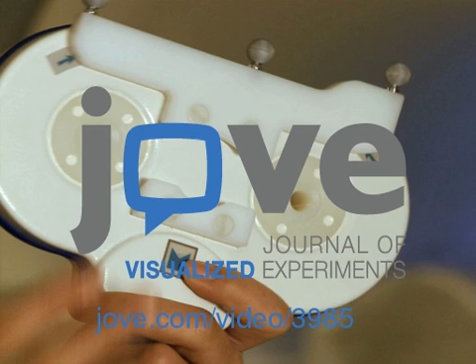On the day of the TMS experiment, set up all equipment, starting with the frameless stereotaxy system. The computer system must be positioned outside of the scanner room adjacent to the door, which will be open during TMS application. The system's registration tools and trackers are MR compatible, as well as a multi-jointed arm. The infrared camera used here is not MR compatible and therefore must be positioned 2 meters away from the scanner bed inside the scanner room near the scanner door.